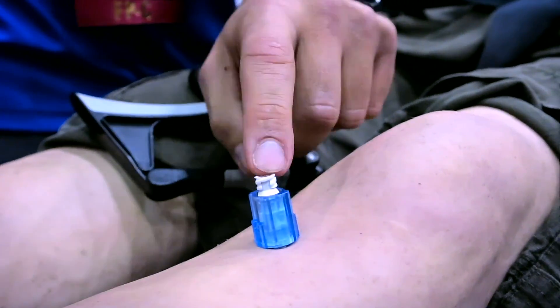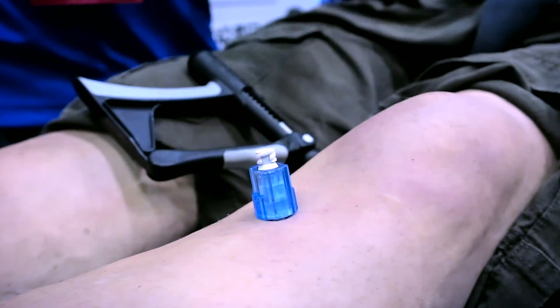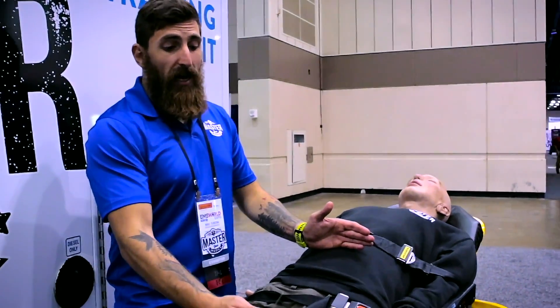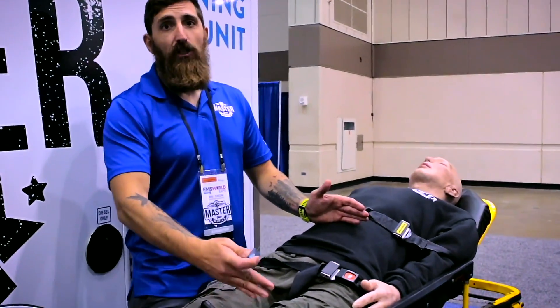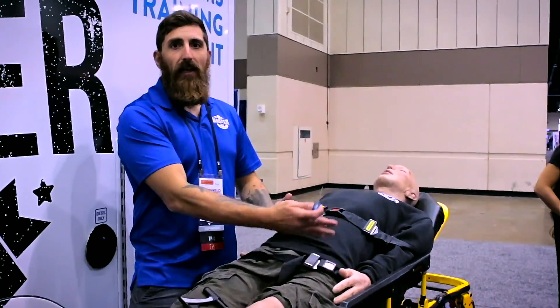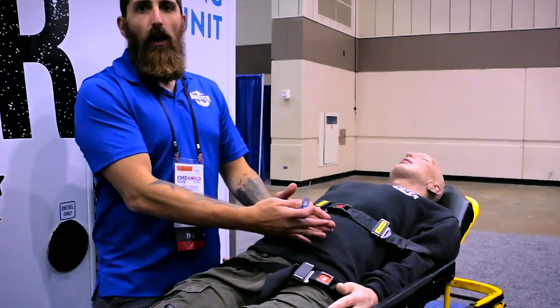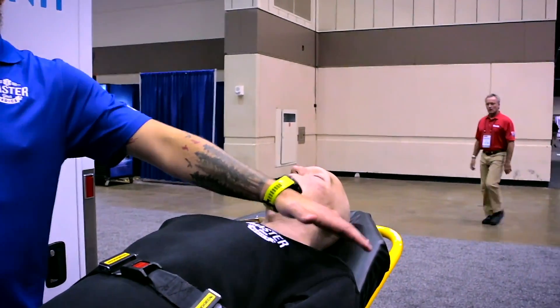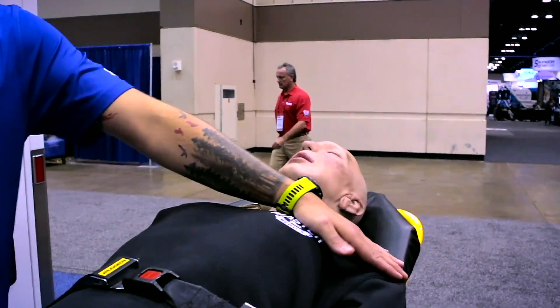Connect and flush your extension set and you're good to start administering. Remember that if you're using the proximal tibia in a patient with severe pelvic or abdominal trauma, there is a chance that delivery of your medication, fluid, or blood product is going to be compromised by non-intact vasculature somewhere along the way. In that case, you definitely want to look at something more central and closer to central circulation.